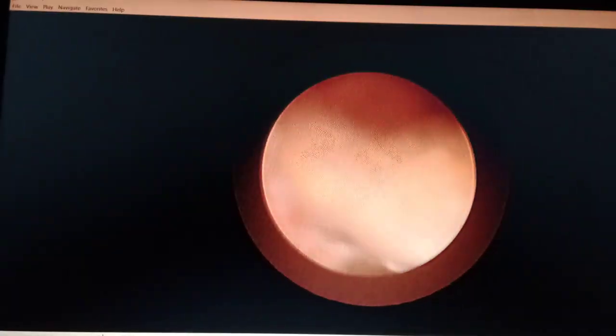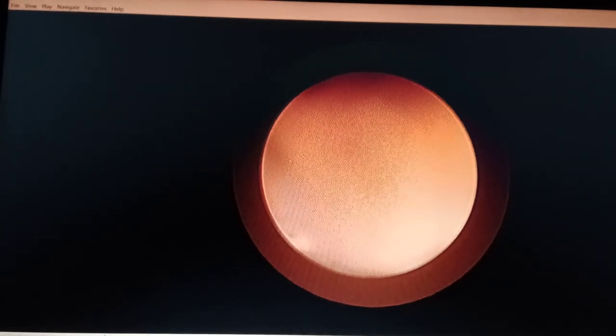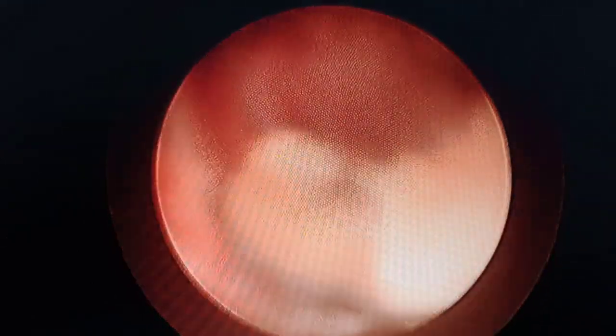The pneumatic lithotriptor has some disadvantages over laser — usually the fragments while breaking tend to go upwards — but it still manages. Now here you can see we have created a small space and we are working over the left ureterovesical area; hydrodissection is doing its part.